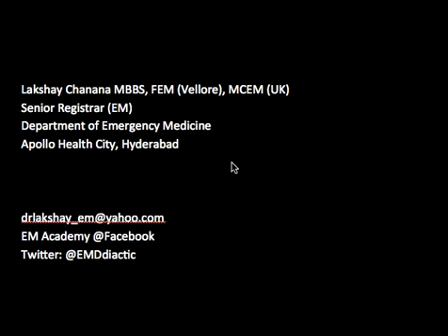Today we are going to talk about the basics of ECG. We'll discuss the steps of reading an ECG. I chose this topic early in the series of podcasts because some of the residents actually came and asked for it, and I've also seen people approaching the consultants and senior faculty about teaching them how to read ECG, how to approach ECG, recommend some books, blogs on how to interpret an ECG.